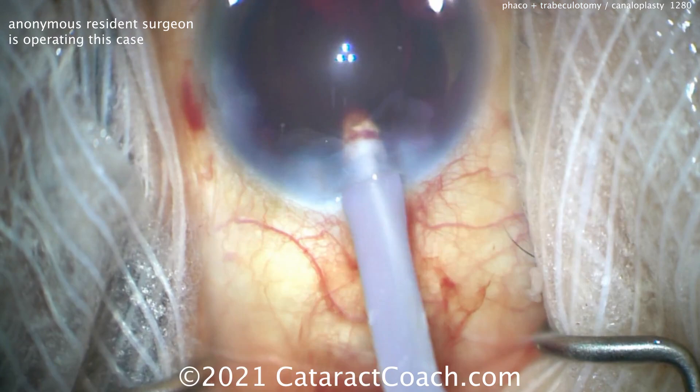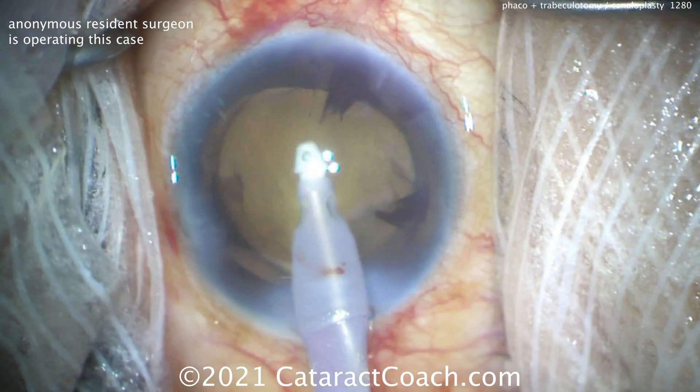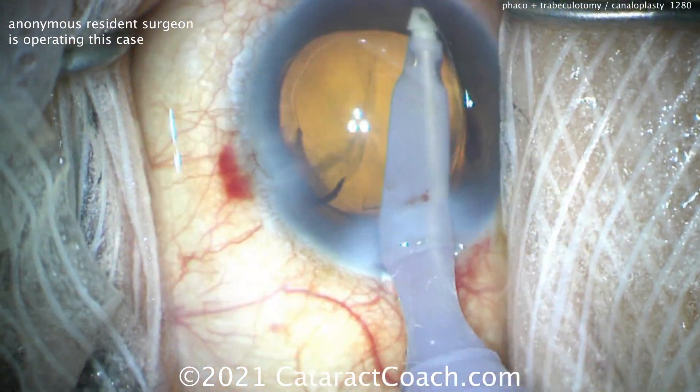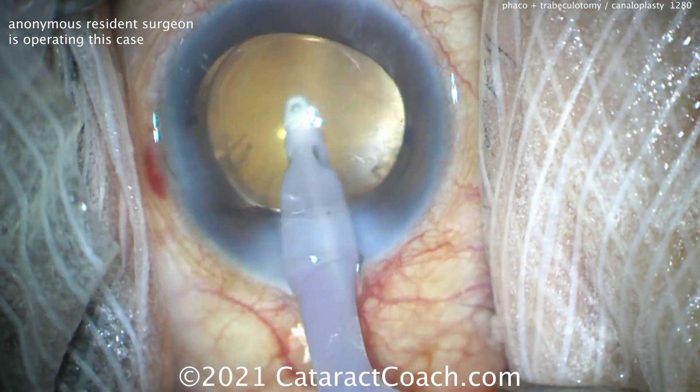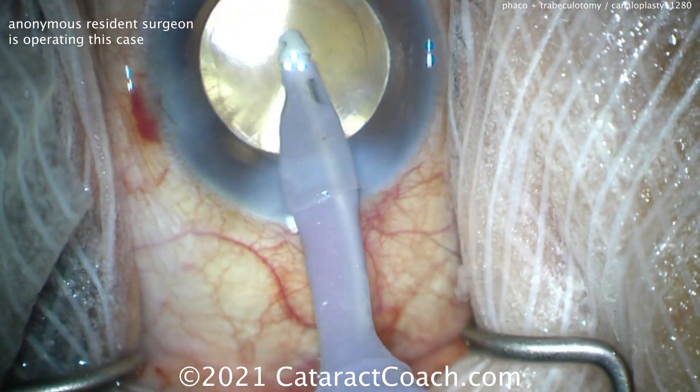It looks terrible now, but let's clean it up. Let's take out the viscoelastic. We're going to keep the eye with a little bit of higher pressure in the post-op period in order to help limit the amount of bleeding, and we'll use an air bubble also — leave some air bubble in the eye, leave a little viscoelastic. I learned that from Ike Ahmed, who is of course the genius when it comes to anything glaucoma.